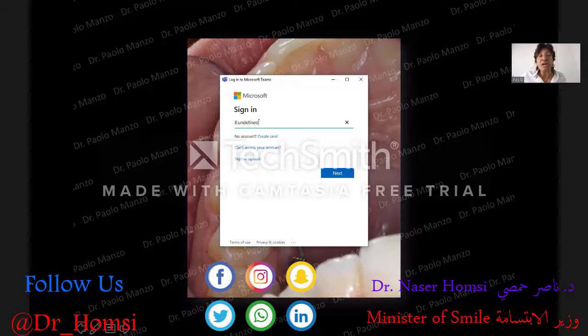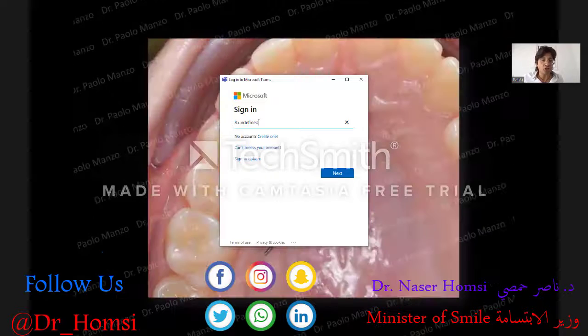And the moment produced for the derotation is produced by the force times the distance. The forces in a system like this are applied mesially and distally to produce the rotation. So the wider the distance, the higher the moment. And the wider distance is easier to apply if we flip the bracket 90 degrees. So we don't use the bracket upright, but we use the bracket flipped 90 degrees. So the moment is higher and more efficient for the rotation. Finally, we had the rotation of the canine.